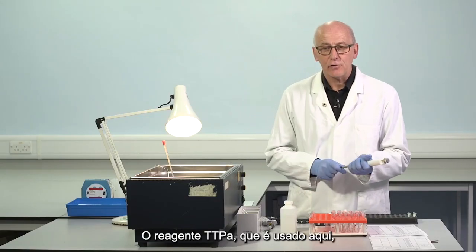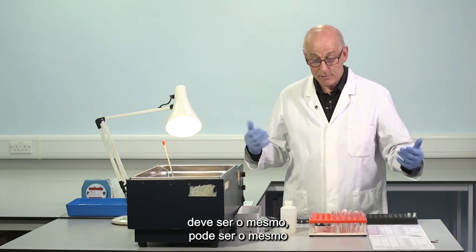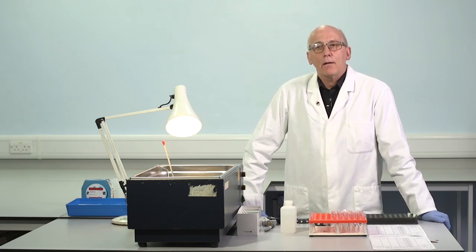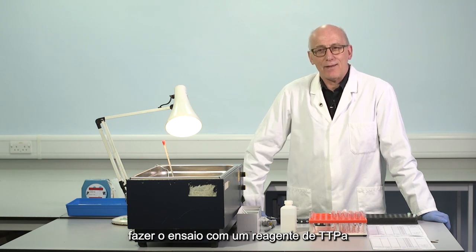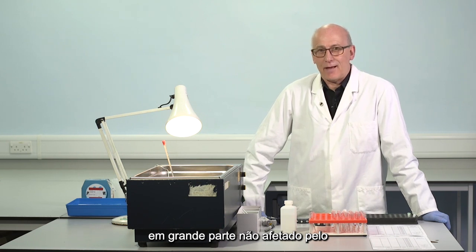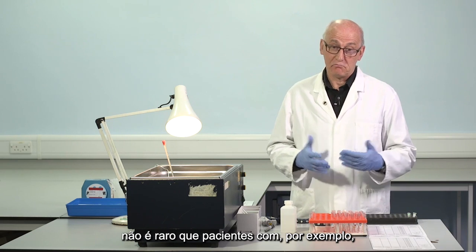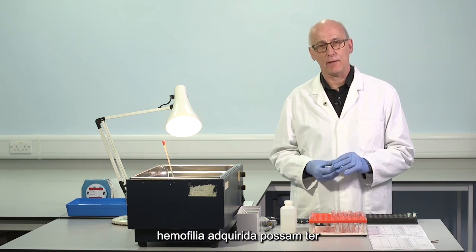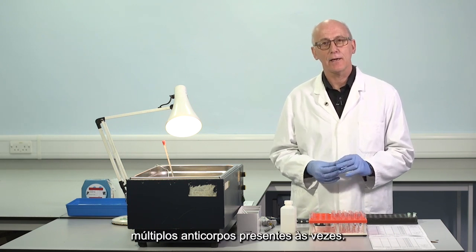The APTT reagent that's used here can be the same one which is used for factor VIII assays. It is useful at this point to make the assay with an APTT reagent largely unaffected by lupus anticoagulant. It's not a rare occurrence for patients with, for example, acquired haemophilia to have multiple antibodies present.